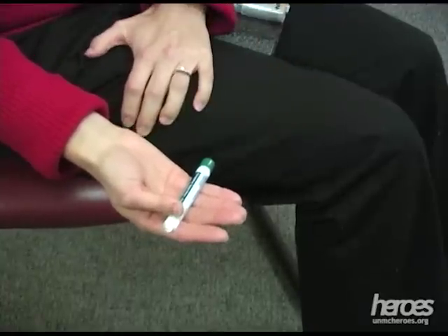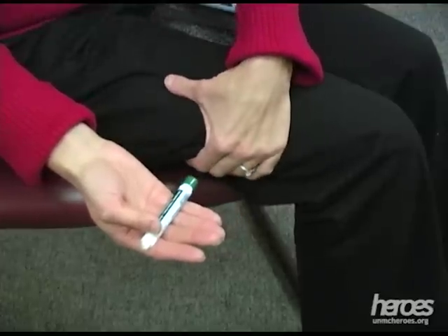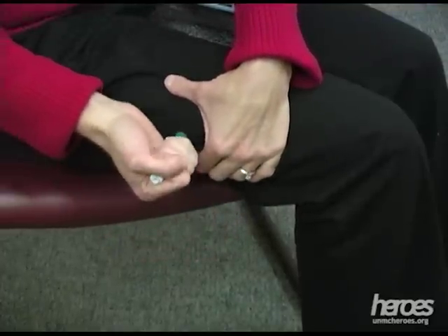Thin people and children should also use the thigh injection site. Use your non-dominant hand to bunch up the muscle to provide a thicker area for injection.